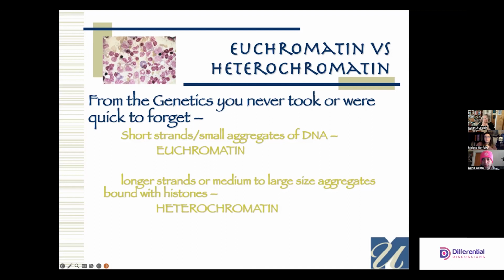Heterochromatin is going to be dense, dark, kind of like almost an airline overhead bin when people are trying to stuff the last three things into it. So you get this sense of denseness, this sense of impenetrability. You get the sense of unevenness, because one bit of heterochromatin is going to be tall, and another one's going to be flat, and another one's going to be on its side. And so they're going to be lumpy, and they're going to be uneven. And again, there's going to be this denseness to it. So that's heterochromatin.